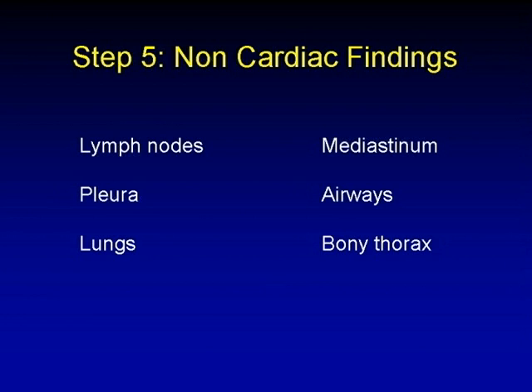Then I read the non-cardiac findings, and I do this every time because A, I don't want to miss it, and B, it's a kind of message to my cardiology colleagues that these are important. That's why I put it at the beginning of the report.